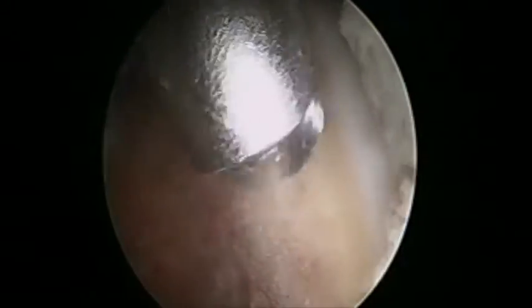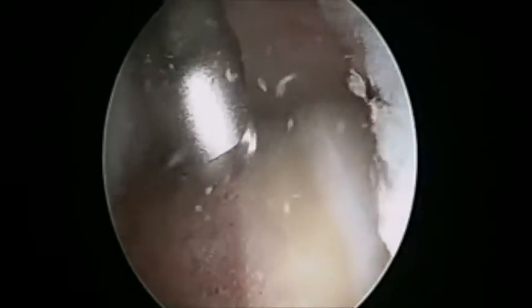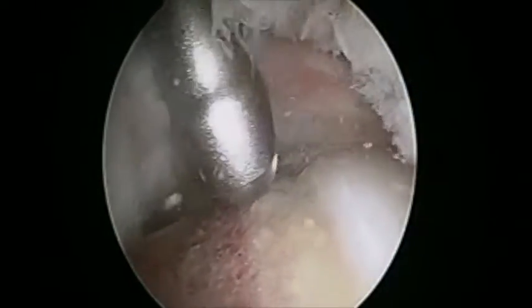This portion of the video demonstrates the importance of choosing an appropriate start point. Too proximal of a start point will not allow for recreation of the spherical head, which could lead to potential loss of suction seal, particularly in deflection.